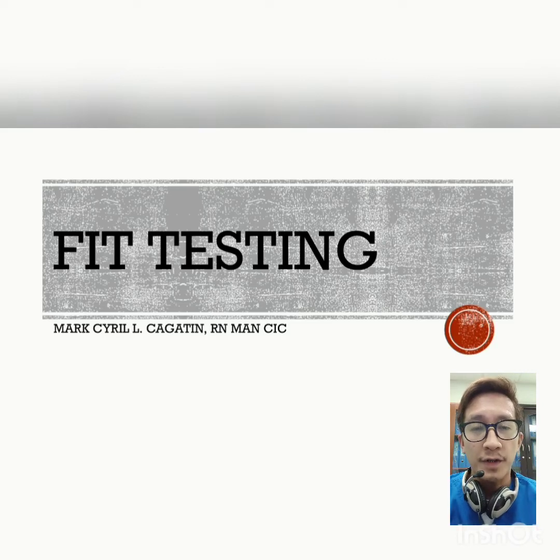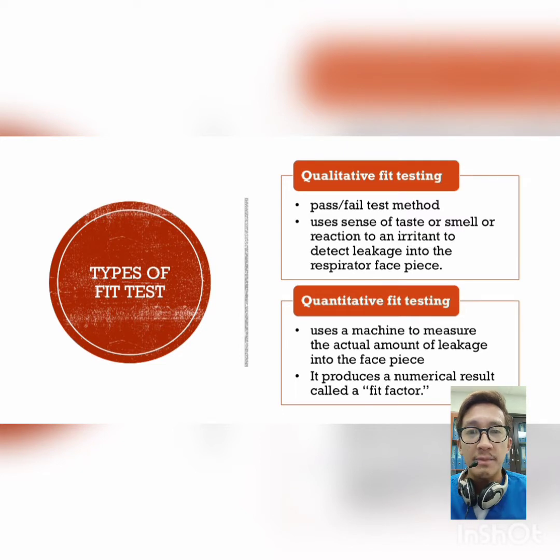Good day, everyone. For today's lecture topic, I will be discussing fit testing, which is one important component in order for us to identify the correct type and model of N95 mask that we will be using, especially if we will be attending to patients with airborne transmitted infections. We have two types of fit testing, which are the quantitative and qualitative fit tests.